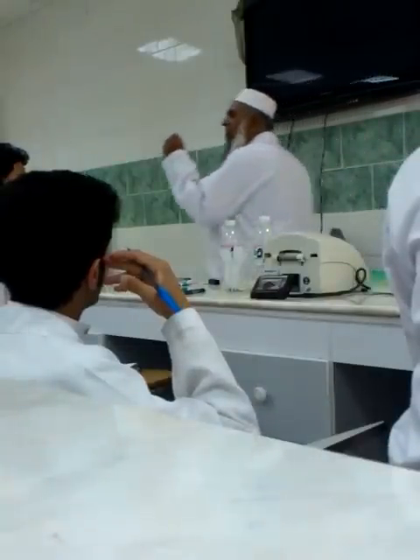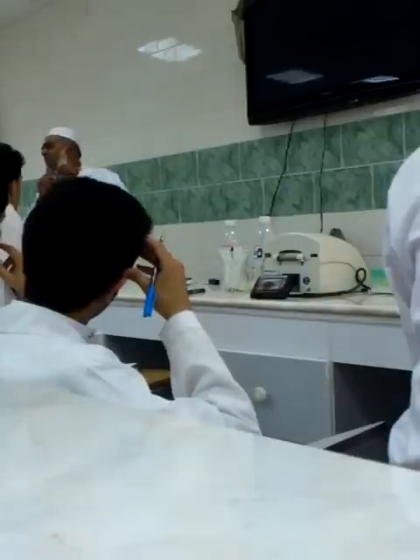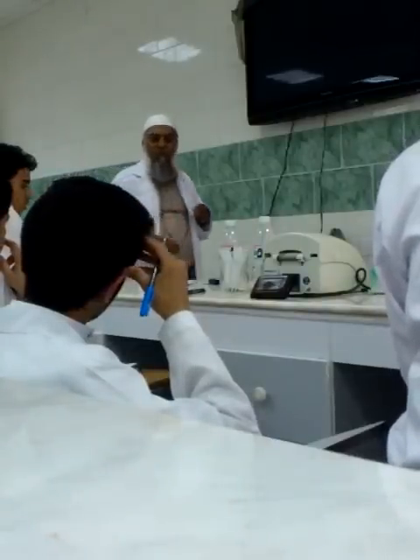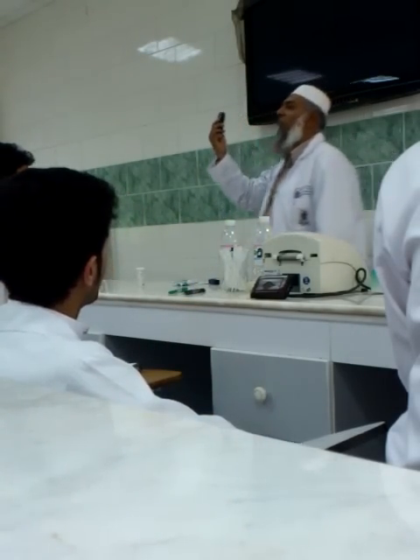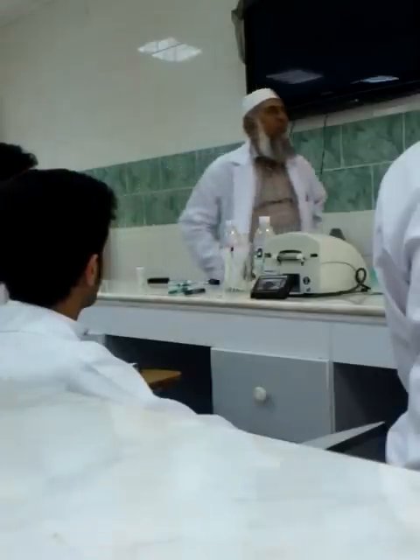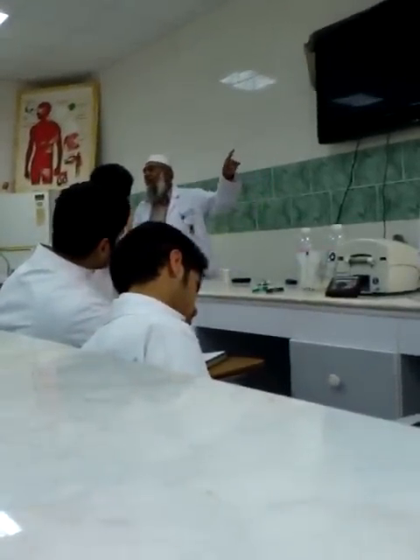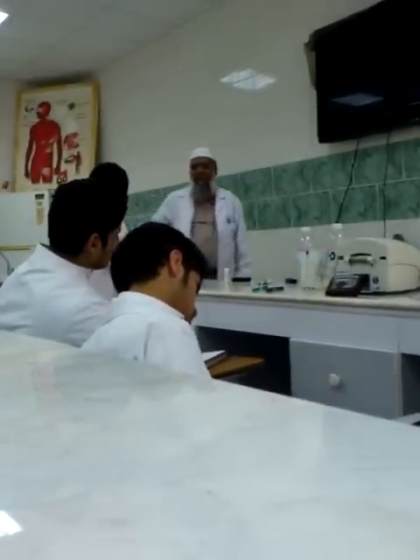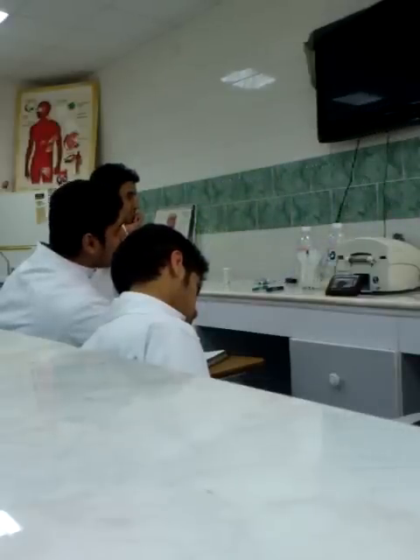Otherwise, if the drop of blood is so small that only half the colored area is covered or less than half is covered, then the glucometer will give you either a wrong value or it will give you a letter E on the screen, like this, letter E. When the letter E appears on the screen, it means error. E for error. Error means wrong.